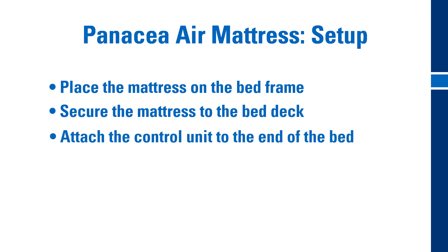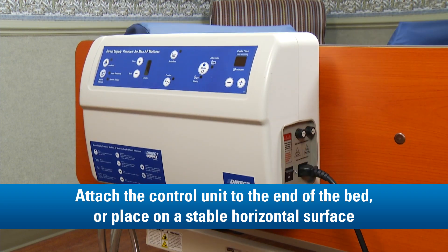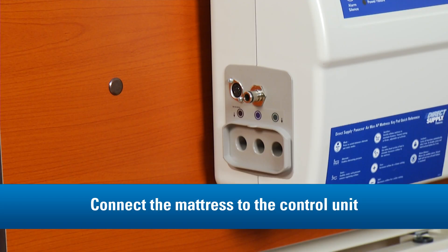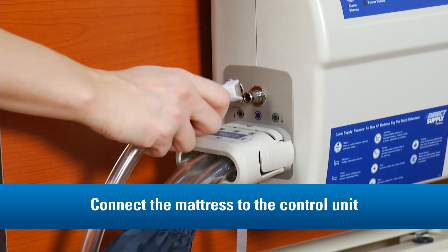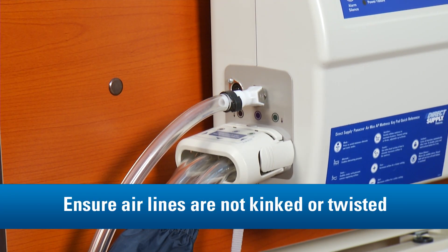Hang the control unit on the end of the bed, or place it on a stable horizontal surface. Connect the mattress to the control unit by pushing the connector into the airports located on the side of the pump until you hear it click securely into place. Ensure the air lines are not kinked or twisted.